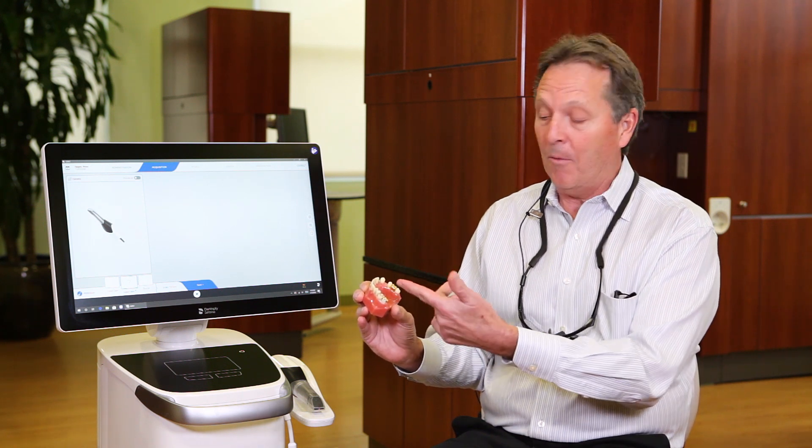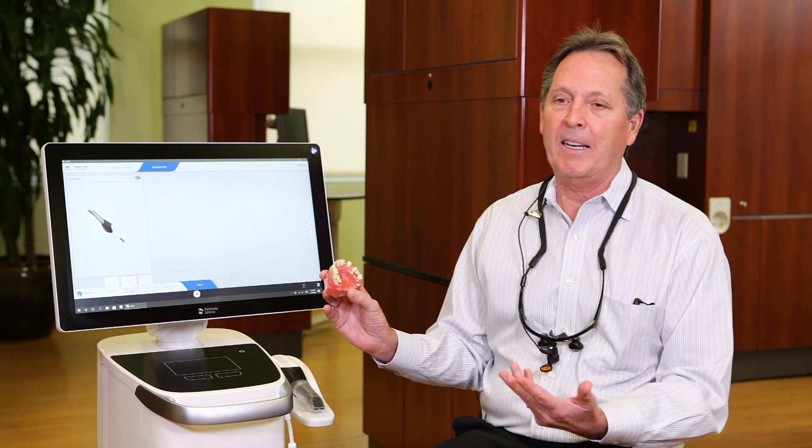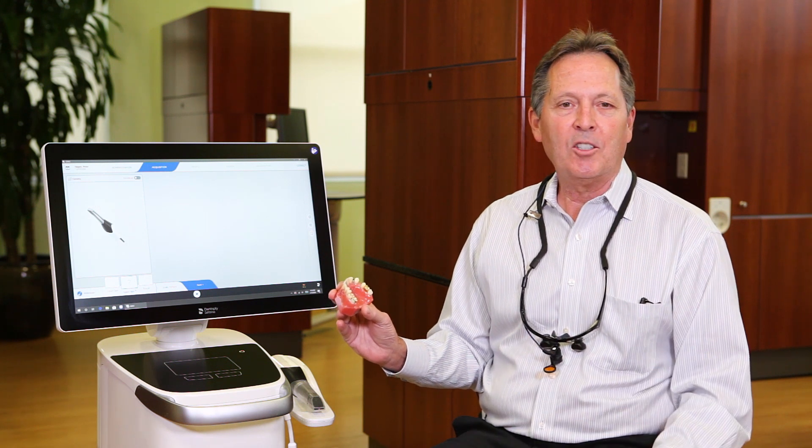There's a PFM with a metal lingual, a bridge, and an edentulous spot. Some of these areas have notoriously given us grief with the Omnicam — highly reflective surfaces, something deep, just difficult scanning.